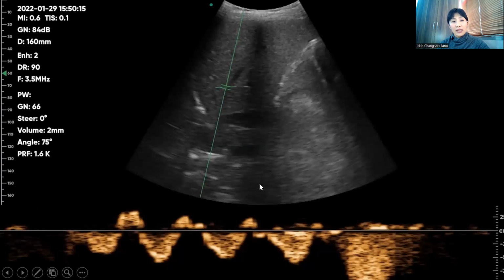Now, what I also like here is that I can use the pulse wave to measure, for example, if there is venous congestion, so I can use the waves to assess if the patient actually has congestion. And if it is improving as I follow the patient up.